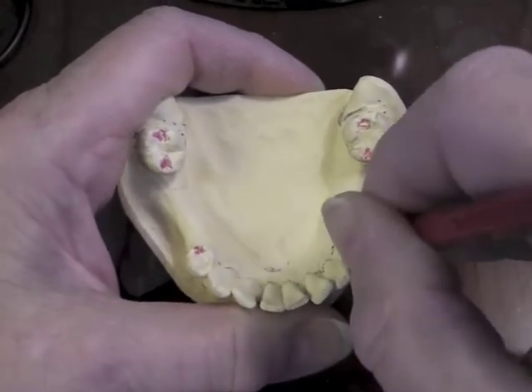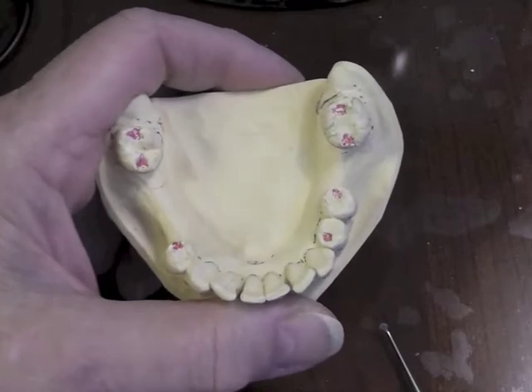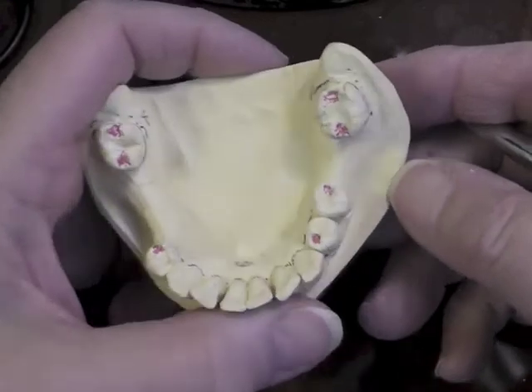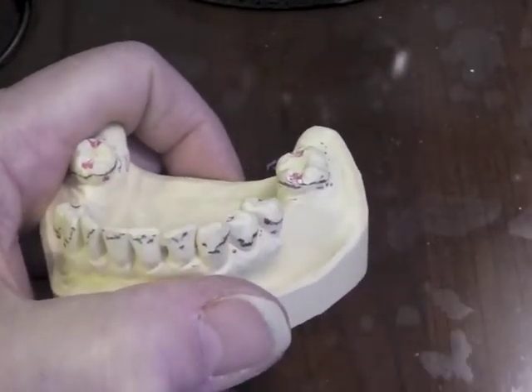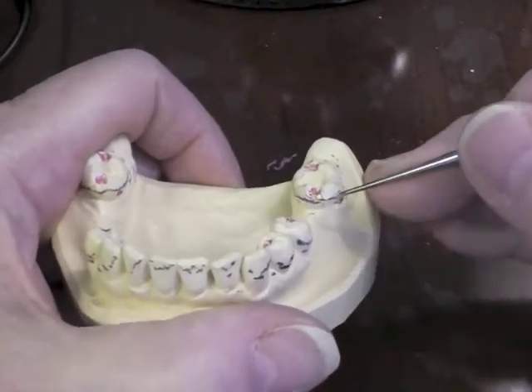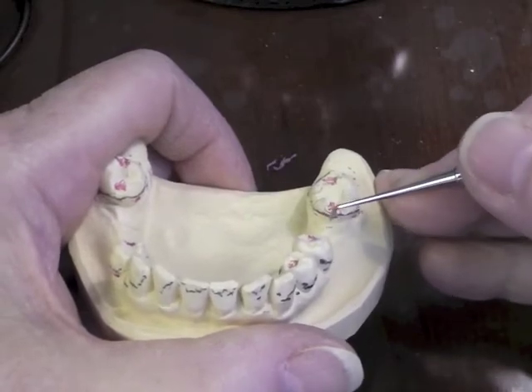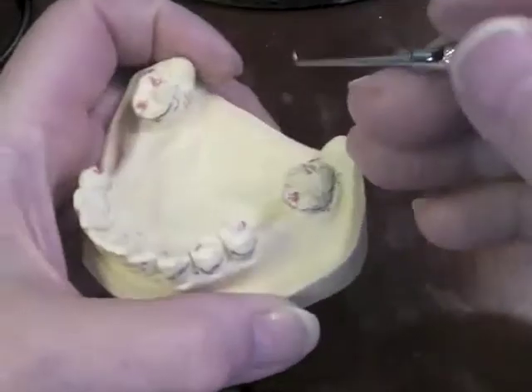We'll have a rest here and a rest right in this area. Now I need to prep these rests — I've done a little bit of it already to expedite this. The first thing I want to look at is my guide plane here, and I want to create a parallel guiding plate or a plane parallel to this tooth over here.